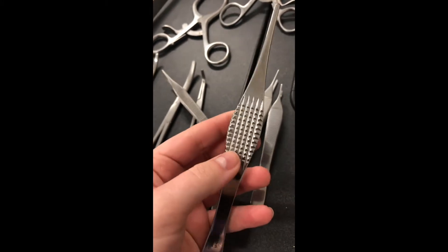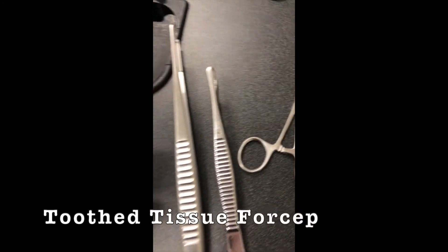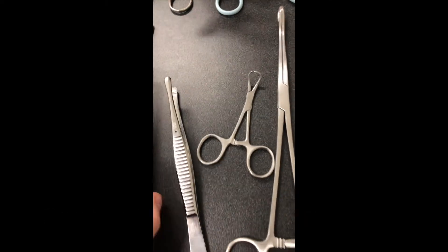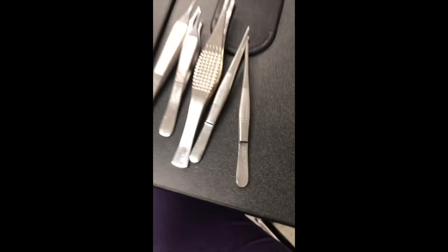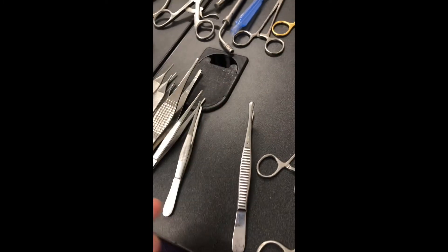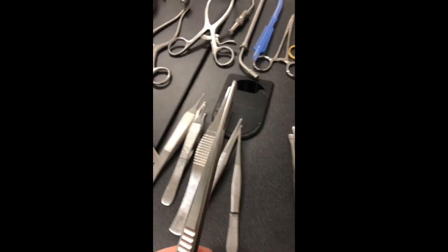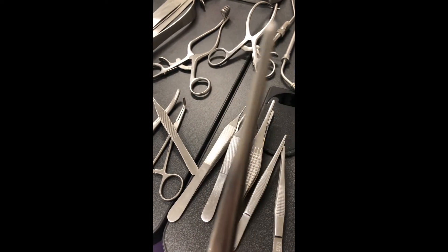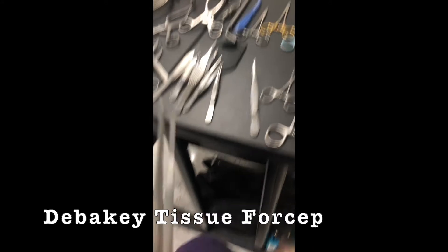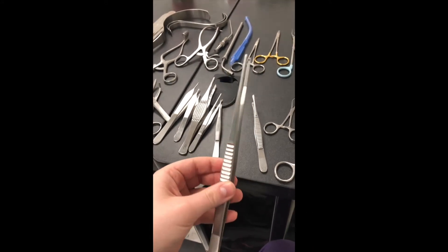Watch Ferris Bueller's Day Off — I mixed them up. Tissue forcep. And then this is the teeth tissue. What's the difference between the Adson and a regular one? The tissue one's a little more meaty. So that's where I got it wrong. And then this one is the very specific one — the DeBakey. DeBakey. Okay, that one's yours — you always get that one right. Every time. DeBakey.